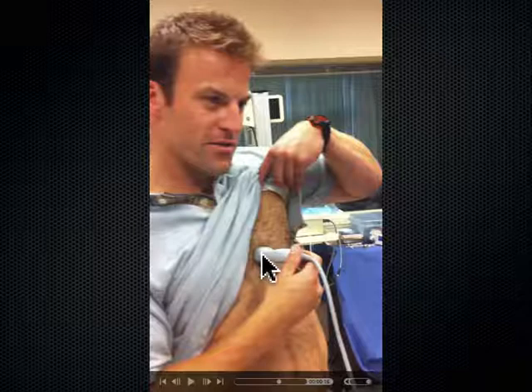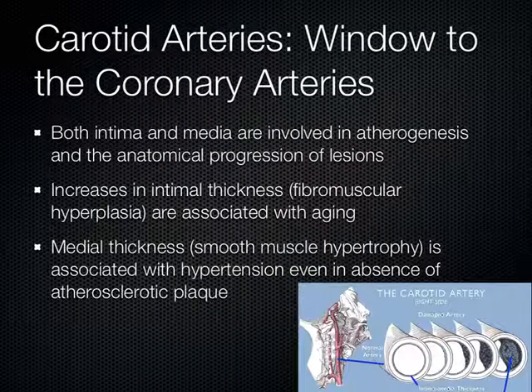This is why when we do this on the patients, we lay them flat and we roll them left lateral decubitus, and that makes the PMI somewhere over here. That's where you'd be putting the probe. But I just wanted to point this out. And he's a really good sport about stuff like that, so I'm sure he wouldn't mind that I stuck that up there. Any questions about that kind of stuff?